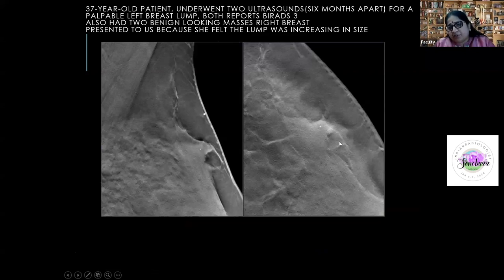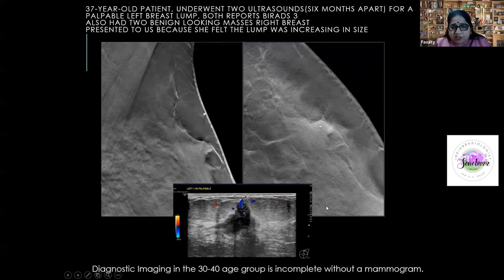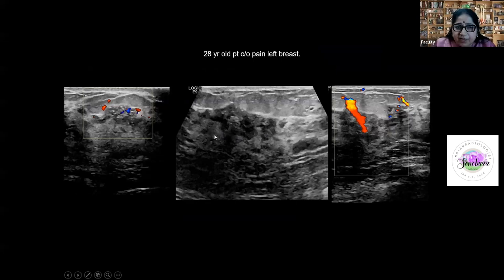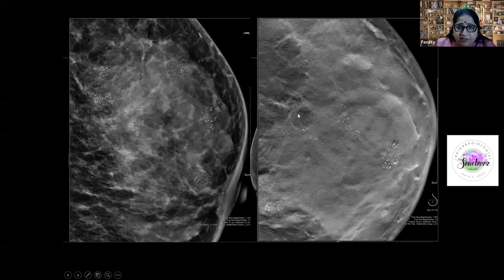Young patients between 30 and 40 should still get mammograms if they have findings that look like fibroadenomas, because we have a significant burden of cancer in that age group. A mass poking out from the fibroglandular interface with microcalcifications is very suspicious — one case was invasive ductal carcinoma. Even under 30, suspicious findings matter: one patient had two ultrasounds reported as benign, but microcalcifications on mammography showed ductal non-mass enhancement — suspicious and requiring biopsy.